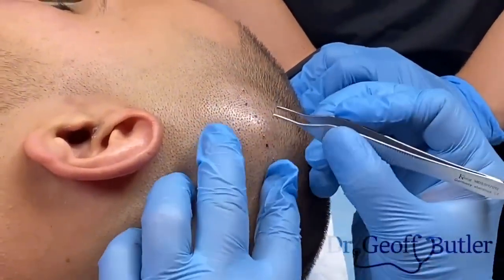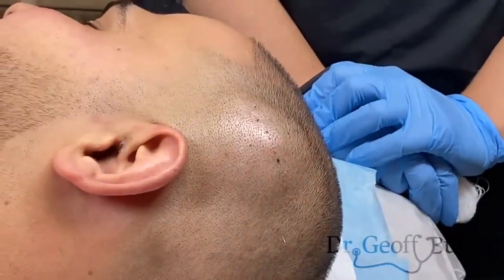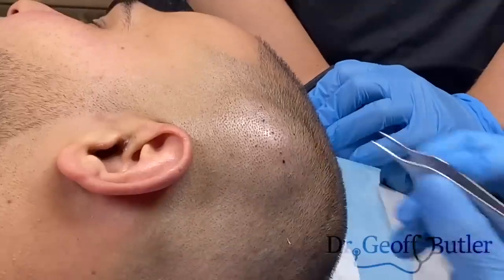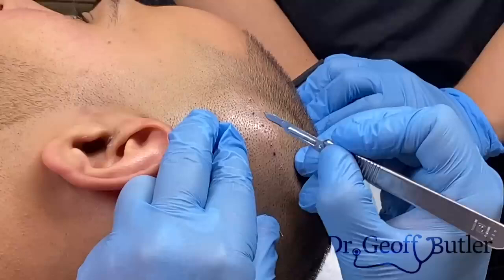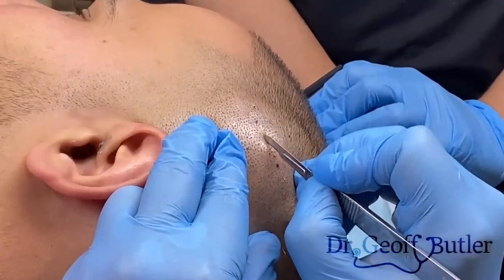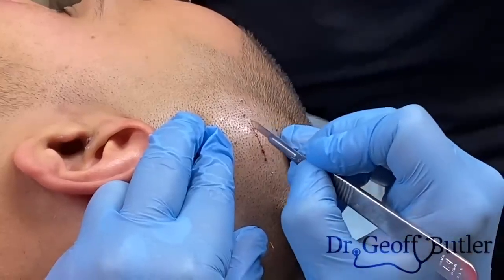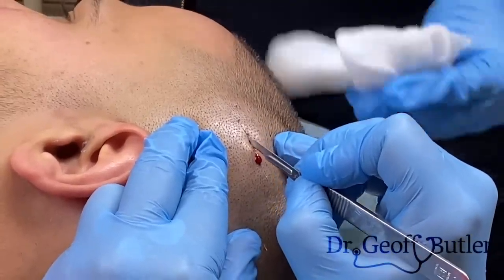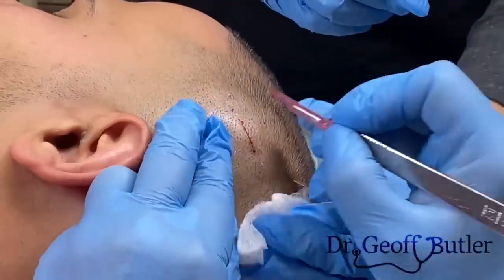He's nicely shaved this down for us, which is really appreciated. I like your hairstyle, it's perfect for us. And we've checked, he doesn't feel this, so this is all frozen. So this is our number 15 blade here. Just have that for me.